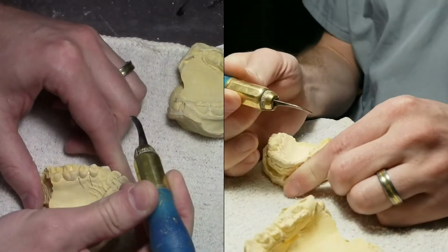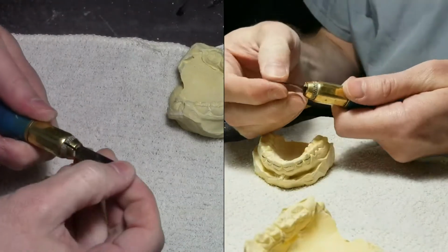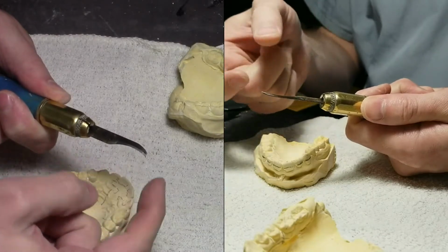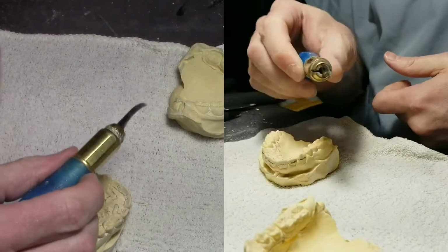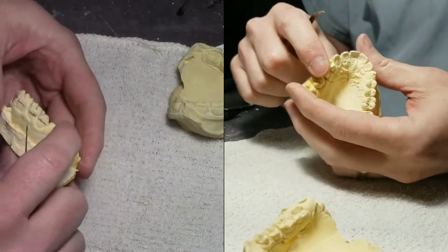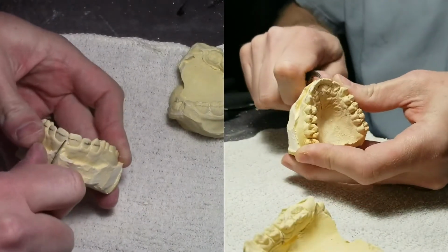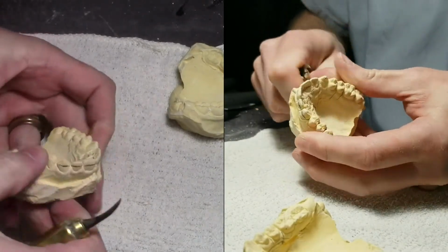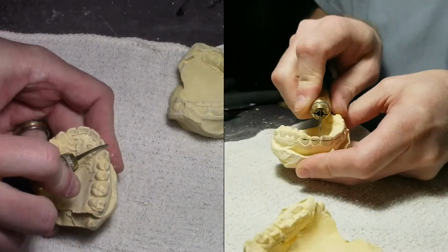So this I get from JBC and Company. It's just a little knife. The blades come out so you can change them when they get dull. I even try to sharpen them sometimes. But you can get packs of 5 blades to keep them nice and sharp. We also use this in opening boxes. I call it my little Freddy Krueger knife. I just like it because of the hook on there, and it's so easy to score between the teeth. Try to make sure I get in between the teeth.